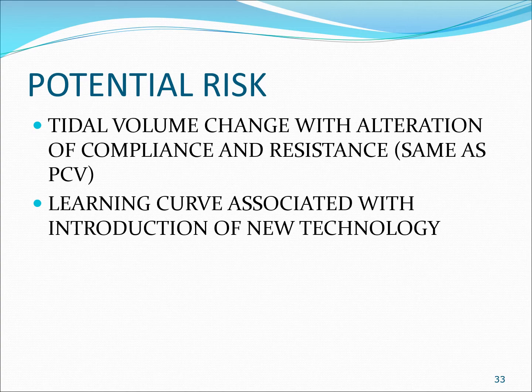Also, there's a learning curve with this. Some people don't like to leave what they know. They know pressure control, they know assist control, they know SIMV, and now they have to learn APRV, and they say, I don't like it, because they don't know it. And once you know it, it's a really good thing.